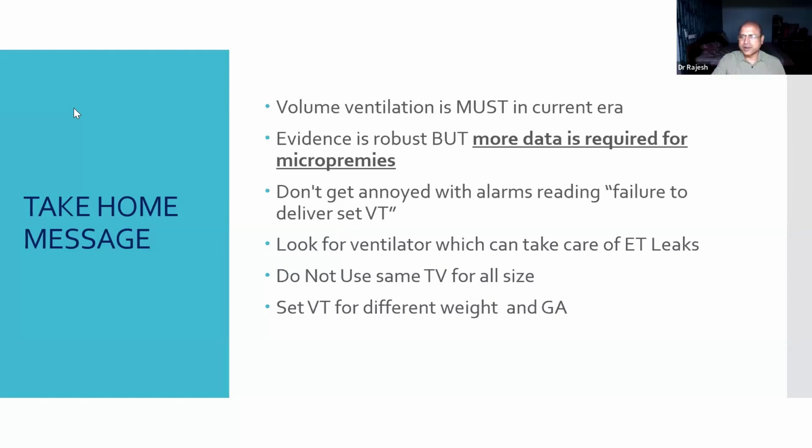Why? Because I'm worried about the tracheal trauma, because that is not a regular practice, in fact. So we are still learning how to use those tubes. Those who are regularly using those tubes are all right with that. Quick ventilation, you're all right with.